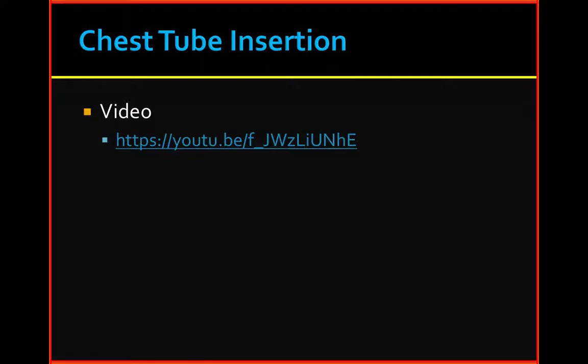A chest X-ray should be performed when possible prior to the chest tube insertion. Where'd you scan that chest X-ray? Sternotomy, yeah, I see some wires right over here. You see the wires? I think you can see on that. Sternotomy patient. So it's got some effusion going on, pleural effusion or blood.